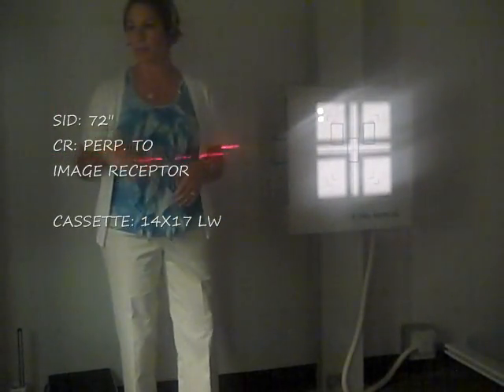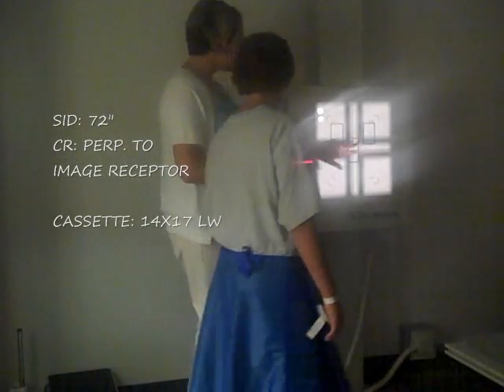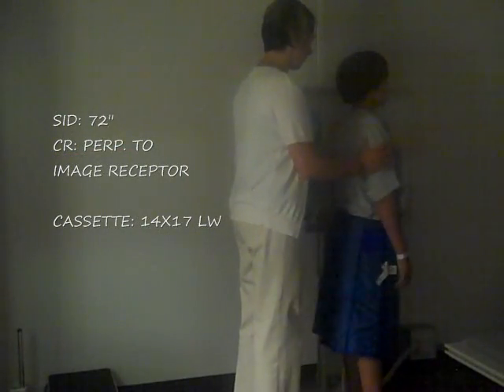I'm going to ask my patient to step into the room using the same 72 inch SID. I'm going to have my patient stand with their left side against the board — so you're facing the back wall. Now what I need you to do is put your hands on top of your head, bring your elbows forward, and then slide right up against the board. You want to make sure that your patient's shoulders as well as their hips are lateral.